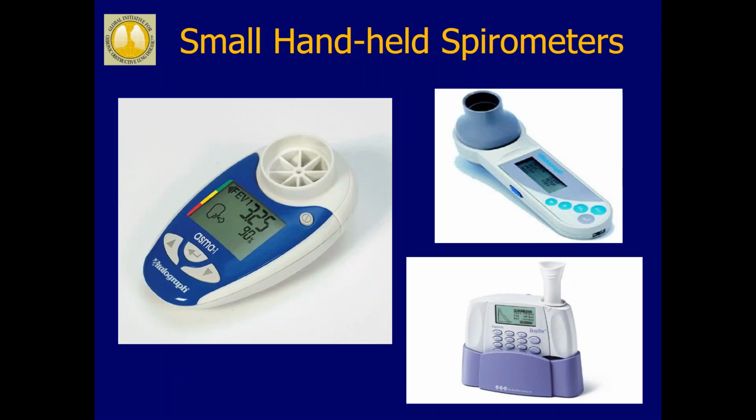These are small handheld spirometers. And although they are functional and can give you some of the values we're talking about, they don't provide a written or printed document of the spirometer results, and that's difficult to use in a clinical setting because it's hard to document that in your EMR and to then request reimbursement.